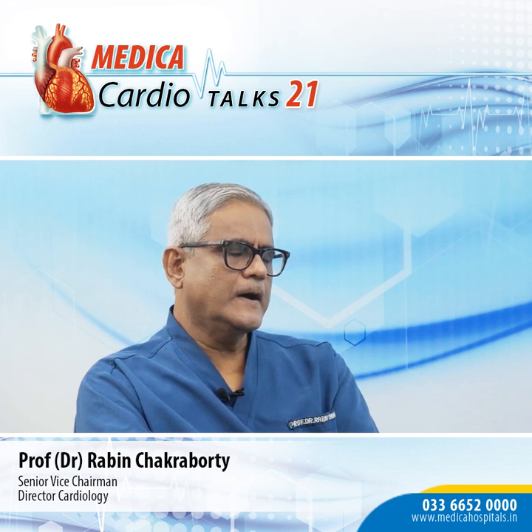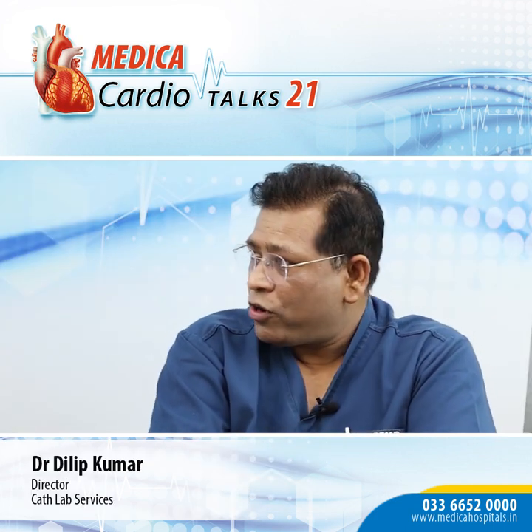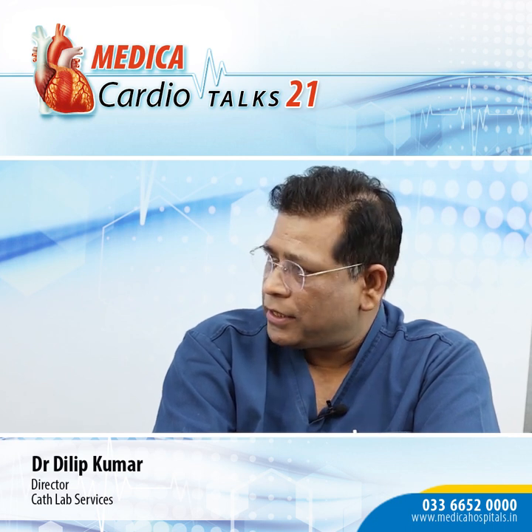And then what is the long-term result that we have right now in the literature after TriClip or tricuspid valve clip repair? Yeah, we don't have much long-term results with TriClip, but still 1-year results are there.